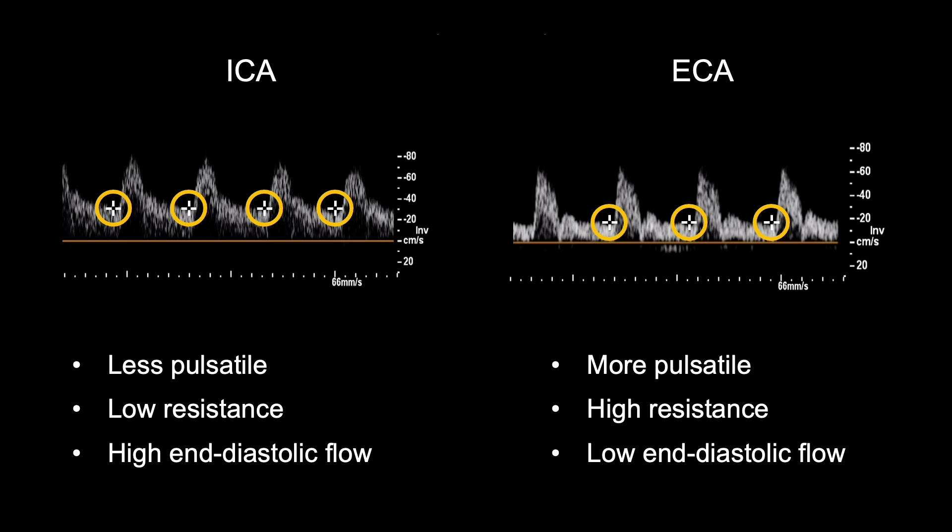The differences in their waveforms are clear, but they also sound very different too. The ICA sounds less pulsatile and more continuous. In contrast, the ECA sounds much sharper, and the pulse is more pronounced. You should learn how to recognise these differences, so don't forget to listen too, because your hearing can be more sensitive.